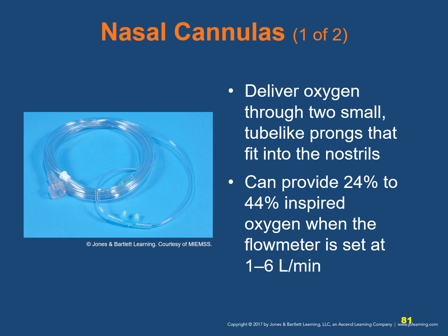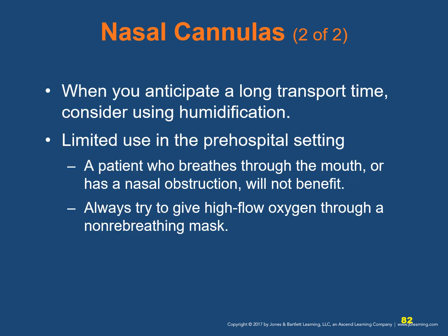When you anticipate a long transport time, consider using humidification. Over a prolonged period, a nasal cannula can dry or irritate the mucous membrane lining of the nose. As I was just saying, make sure to use humidification for a long transport time.